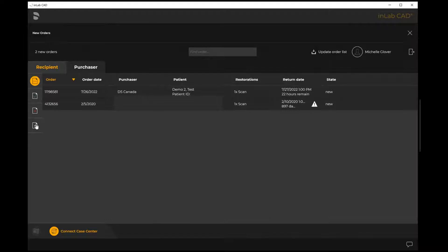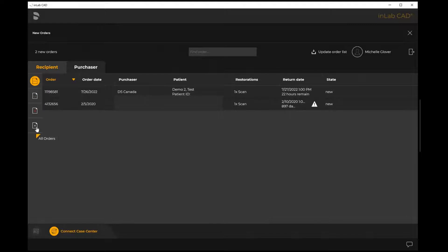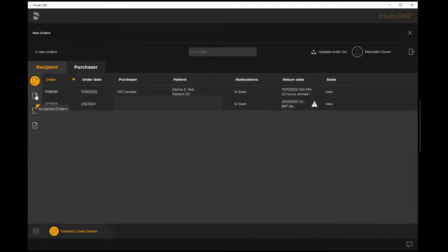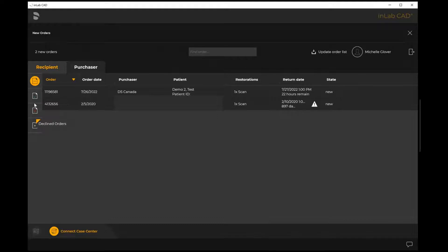On the far left hand side here we have new orders highlighted, so anything that's new will show up here. Then we have accepted orders. You do have the ability to accept or decline your orders. The reason that somebody might decline an order - let's say the scan might have a gap in it or the margins not clear. A laboratory has the ability to decline a case from the purchaser.